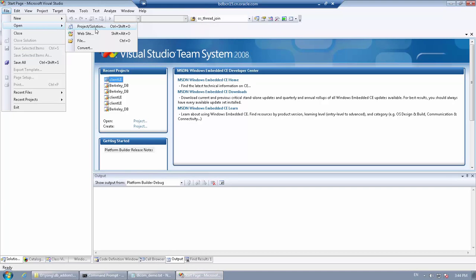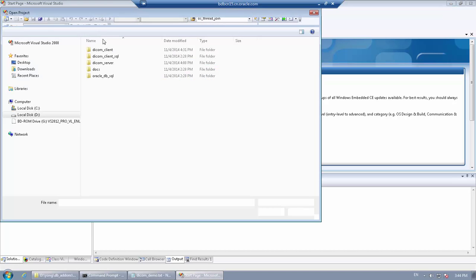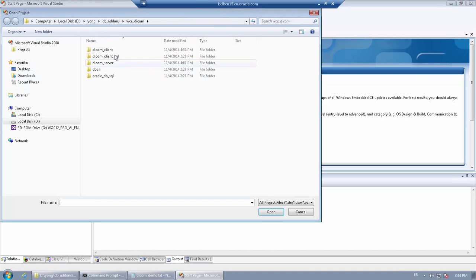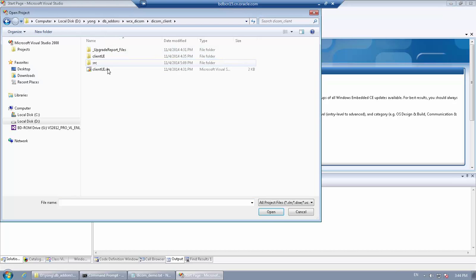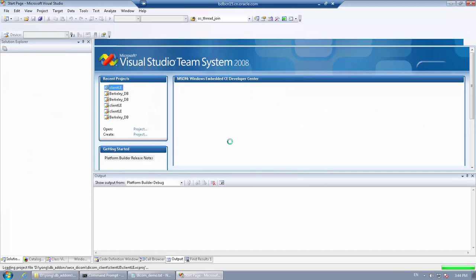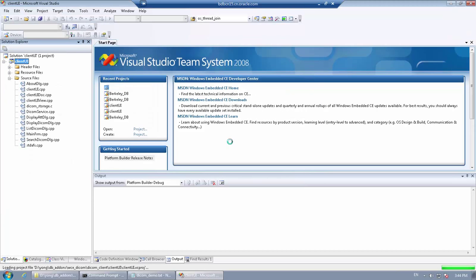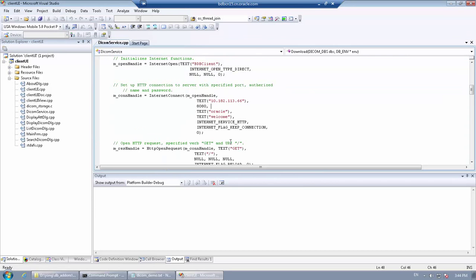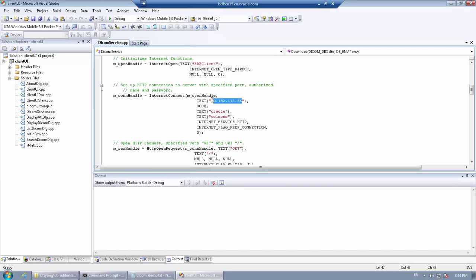Let's complete the picture with the client program. Open the client program in Visual Studio. Modify the IP address in the DICOM service file to the IP address of the application server.